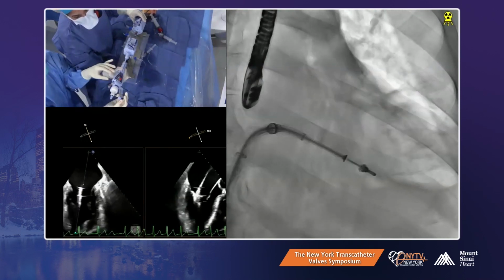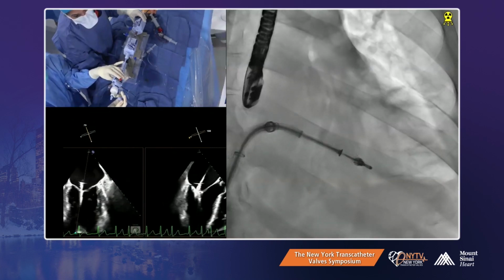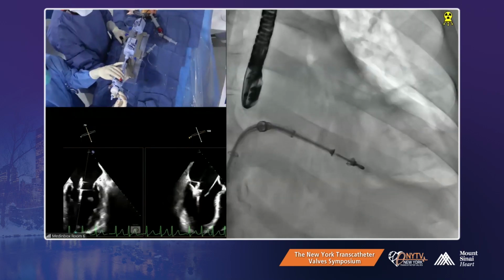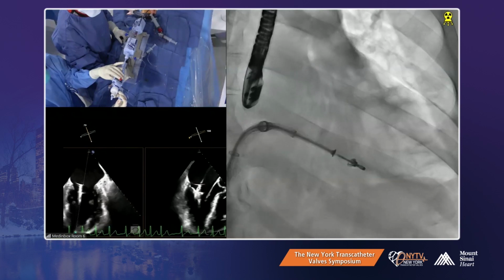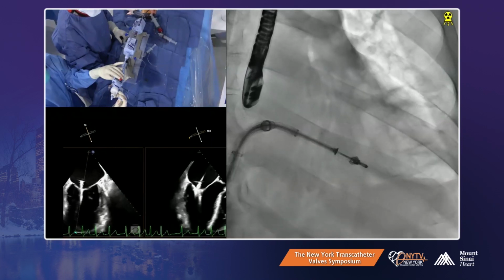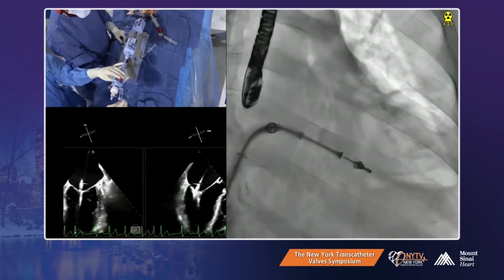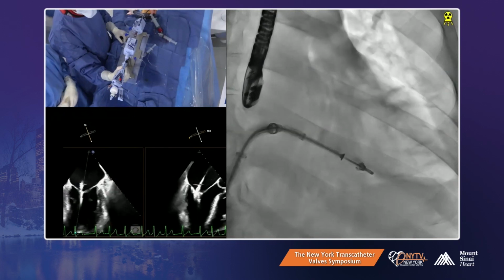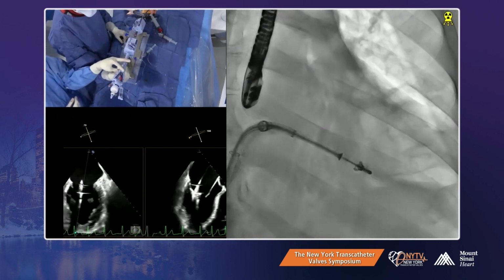Why don't we do separate? Should we just get posterior first? Grasp. Yes, tactile is posterior, right? Why would you not do independent grasping? I worry in this situation that you're a little bit off angle, even though you think you're not. I would look really carefully. I think independent grasping or the Tarzan maneuver is a last resort. You always want to try to get both leaflets together so you don't twist it or tear.